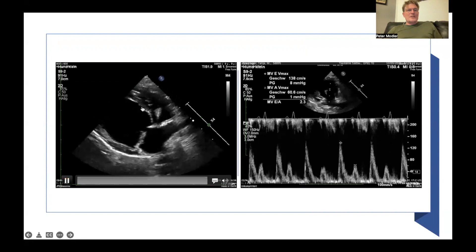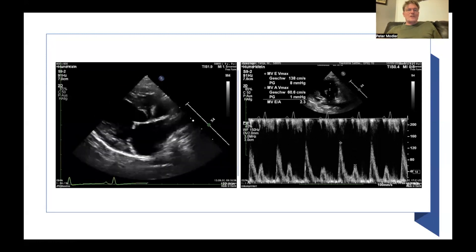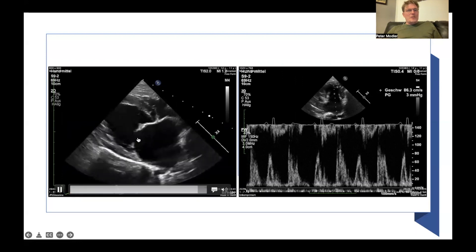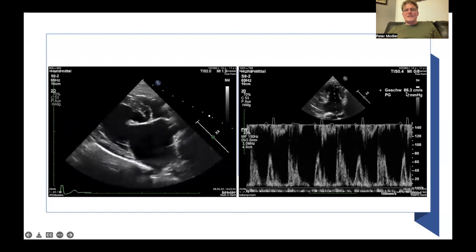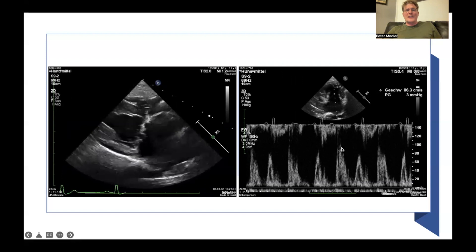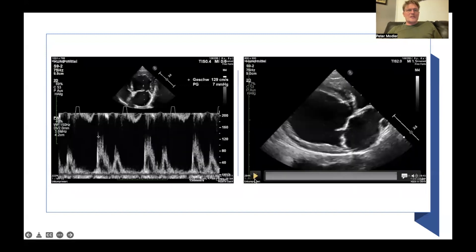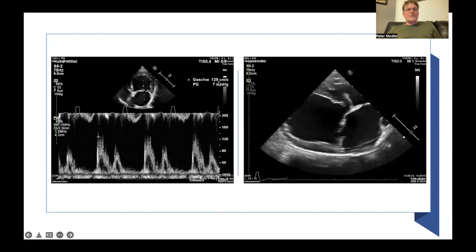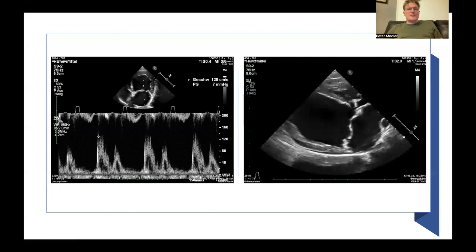Another patient with left ventricular volume overload and left atrial enlargement has an E wave still below 1.4 meters per second, making congestive heart failure quite unlikely right now. A smaller patient — also with left ventricular volume overload, a non-straight septum, and an enlarged left atrium — has an E wave of 0.86 meters per second, meaning filling pressure is not very high and congestive heart failure is extremely unlikely. Yet another patient, possibly a Cavalier, with left ventricular volume overload and left atrial enlargement has an E wave of just 1.3 meters per second — monitoring makes sense, but congestive heart failure is very unlikely.